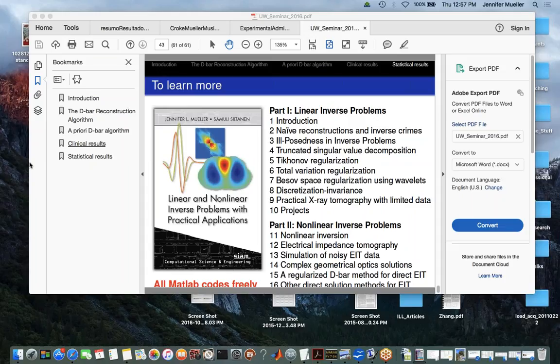The real-time paper appeared in the journal called Inverse Problems in Imaging, I think in 2014. Everything's really spelled out there, like how many frames a second, what kind of computer we timed it on. We timed it on a couple different ones, and we used various numbers of cores. So it tells about how many cores, and of course it depends on how many pixels you're using, if you use a fine mesh or a coarse mesh. So if you want all the gory details, you should go to the Inverse Problems in Imaging paper.